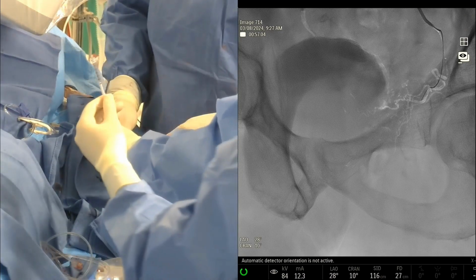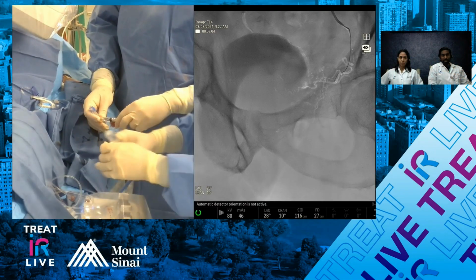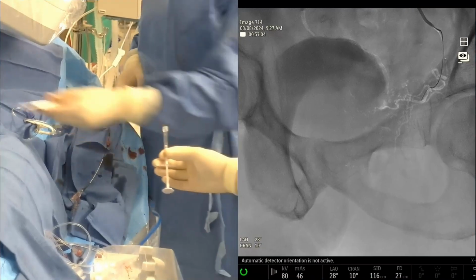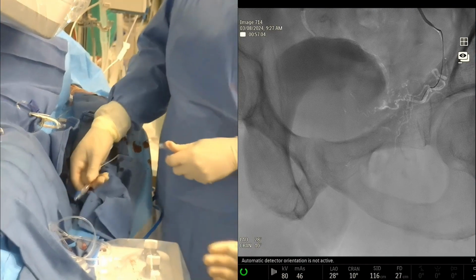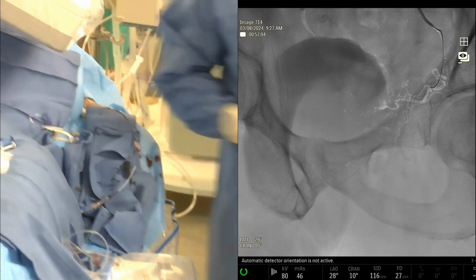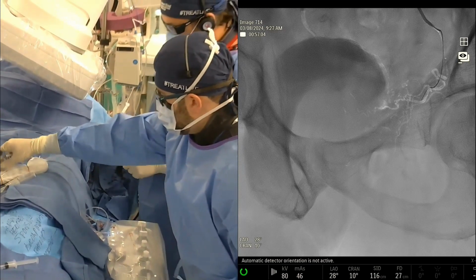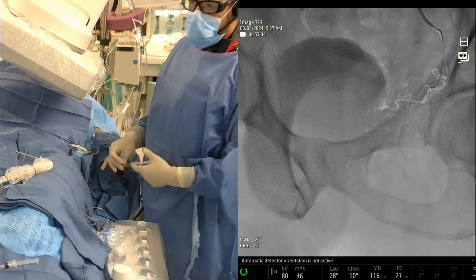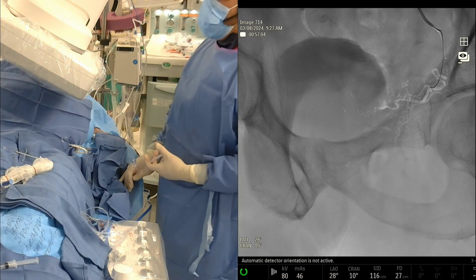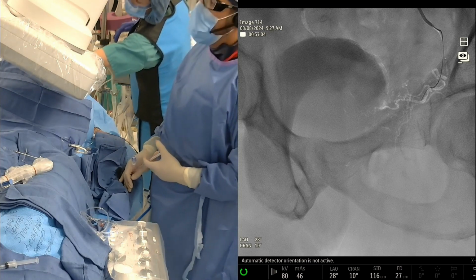And again, 8 minutes. What's a good spot for embolization? Well, we want to be as deep as we think we can get. I mean, we don't want to go too far. We're going to do one more angio. The old perfected technique that Carnevale demonstrated, you do proximal first and then distal, but that really only applies to particles. It's not as relevant when you're using a balloon and/or liquid embolic. And so this is another reason why we like this, because it can actually get a proximal and a distal embolization with one injection.